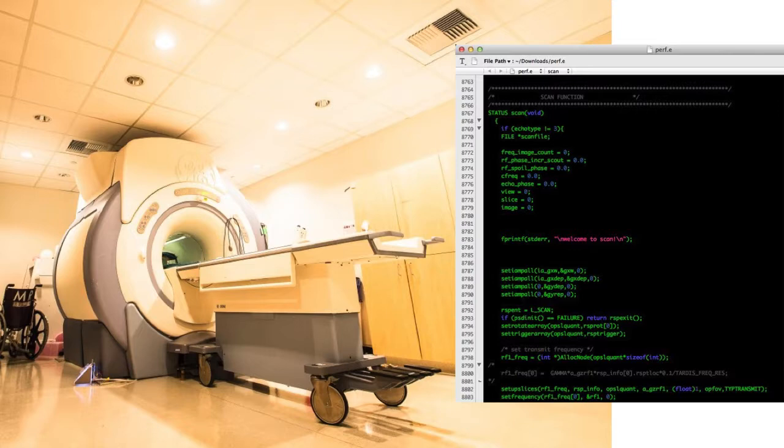So the scanner is a programmable device that allows us to alter the way that images are acquired and reconstructed. And by digging deep into the software that runs these scanners, we're able to leverage some recent breakthroughs in what's called sparse signal and image processing that have allowed us to produce order of magnitude improvements in spatial resolution and temporal resolution. Our work is done on commercial scanners.